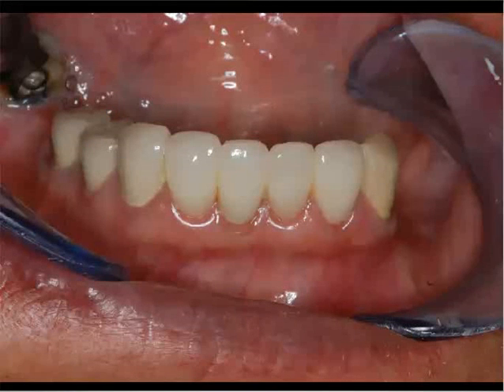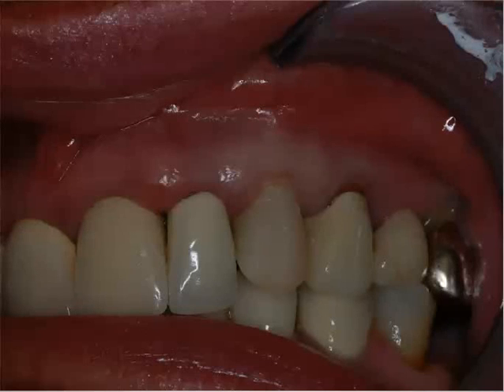And then we have these well-fitted pressed ceramic crowns that we place, an absolutely wonderful marginal fit from those. We also have to keep in mind as we get into some of the other issues that can come into play is the use of tissue retraction when the conventional cords or gingival paste really is not apropos because of the depth. In this type of situation, when we're placing post-and-cores or pin cores, we need to have at least 3 millimeters of natural tooth to support the post-and-core, the ferrule effect. We need to get a little bit deeper, and we're probably 90% of the time right now using fiber posts for doing this.